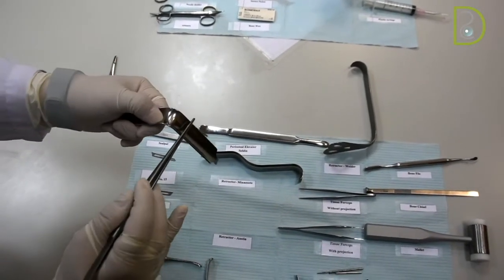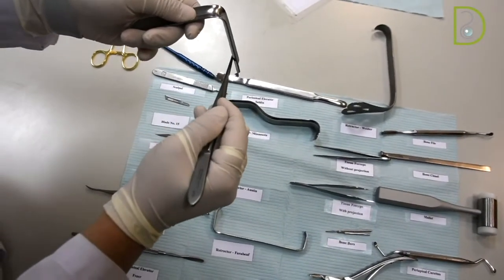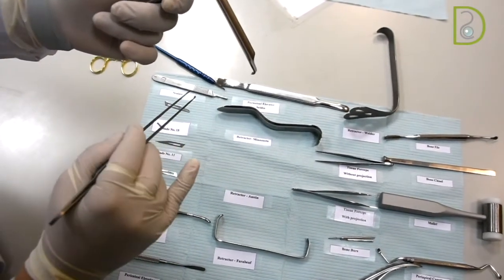in the same manner. This is the bone facing side. This is the soft tissue side. It's convex and smooth. And over here, just to ensure there will not be any slippage.